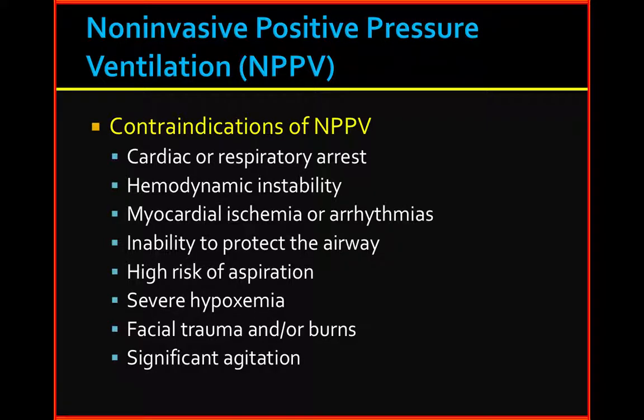The only other concept I want you to remember is that there's this inverse relationship between volume and pressure. Volume and pressure can be done for basically all of these, and you have a choice. Some ICUs or critical care docs will be all about volume control. That's usually the easiest one to understand, and there's a little graph here I'm going to show you, but that's all I want you to remember, and then you'll see the next part. We will start with volume control modes.